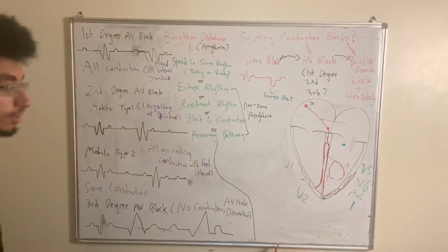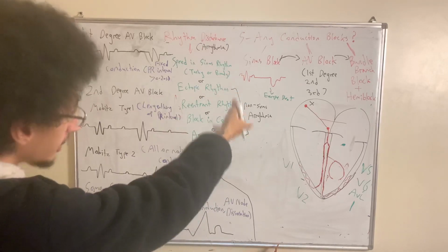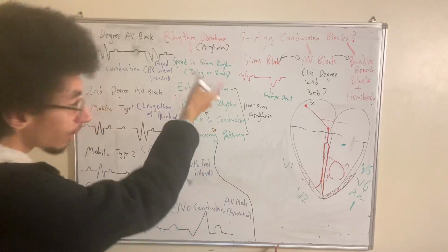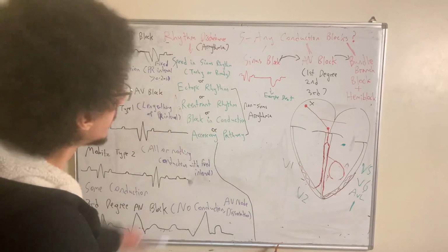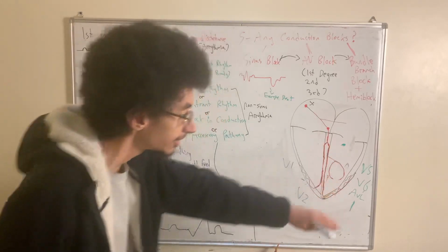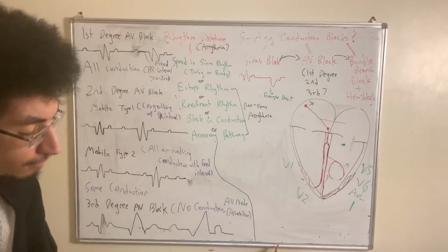Or, another word, accelerated idioventricular rhythm, or escape beat, whatever you want. A bizarre wide-shaped QRS without any P wave. And this is life-saving, because this is basically the pacemaker of the ventricle trying its best to save itself, since the SA node is no longer functioning.